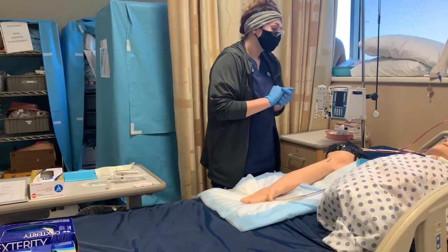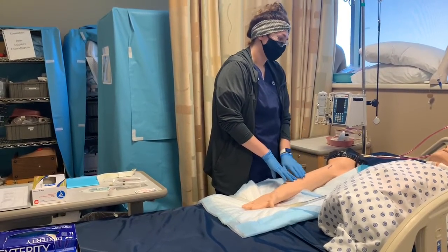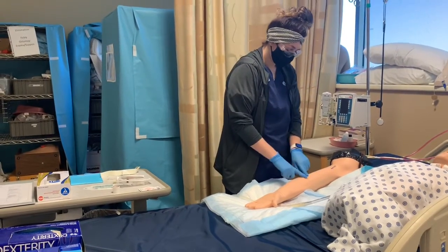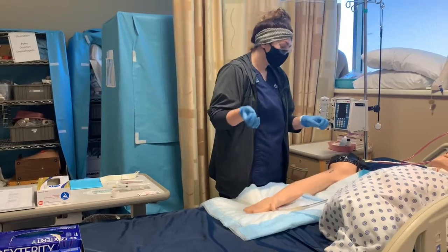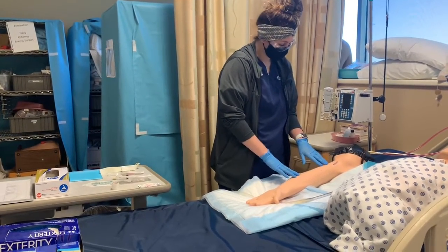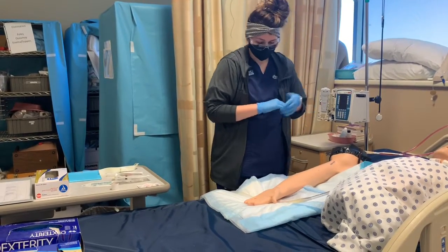So Ms. Jones, today we're going to be inserting an IV into your arm in case you need any medications that require that route. All it is, I use a needle to put a little cannula into your vein here in your forearm. Then I pull the needle out and just leave the cannula in there with some tape on the outside. Okay? Do you have any allergies that you know of? She said she does not, so that's good.